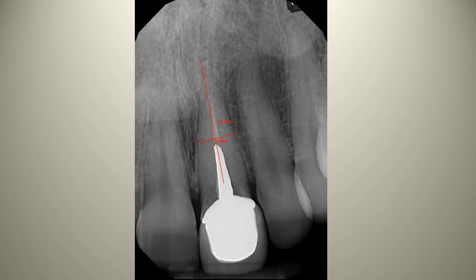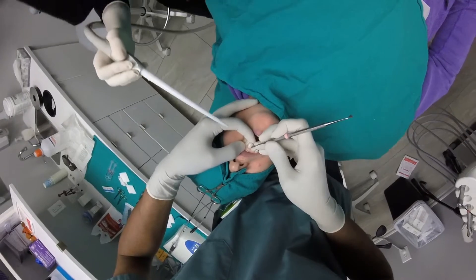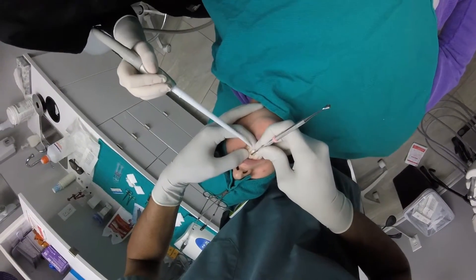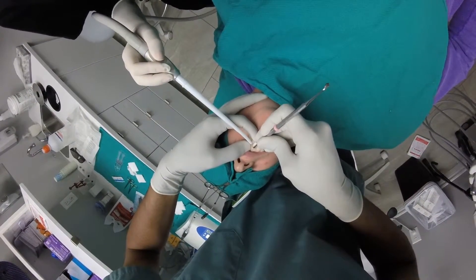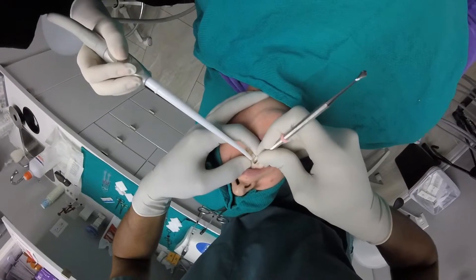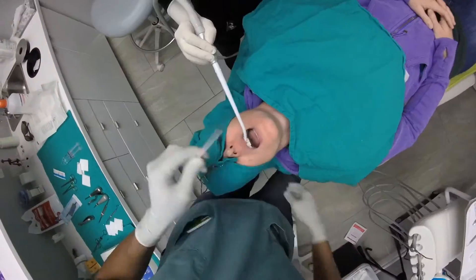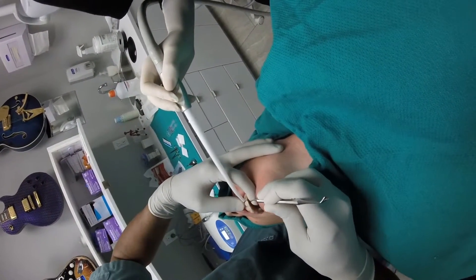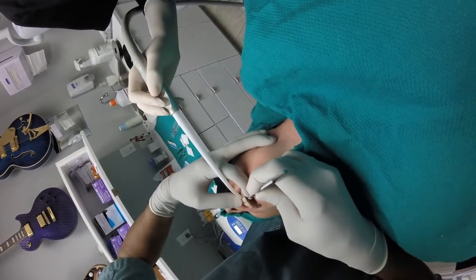The purpose of this case presentation is to highlight the actual atraumatic extraction, and we'll try to go gate to gate and provide as much display of the whole process as possible. In this video, you can see that I've taken my favorite instrument, called a Woodson Elevator. The beauty of the Woodson Elevator is three things: it has a very thin handle, and the shank and blade of this instrument are fairly thin, making it very easy to get between the attached gingiva and into the periodontal ligament to start luxating the teeth and reduce the amount of attachment the tooth has in the residual socket.